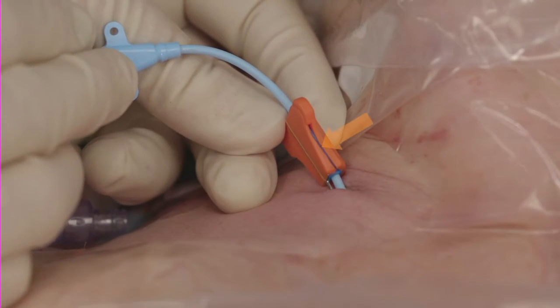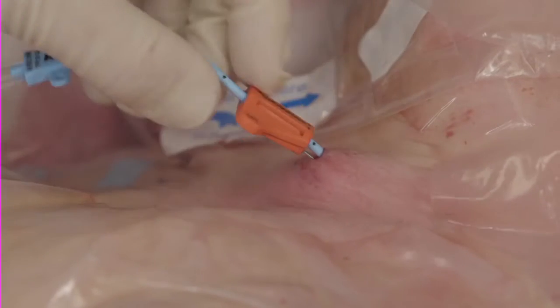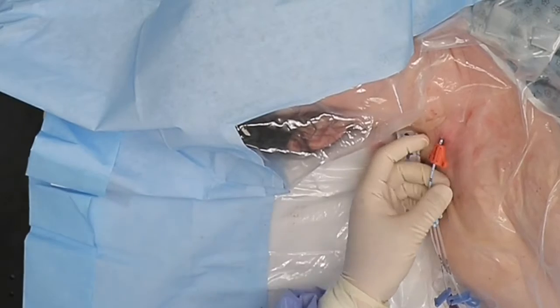You should not be able to see a gap along the edges of the SecuraCath. Gently tug the catheter to assure SecuraCath and catheter are secured.